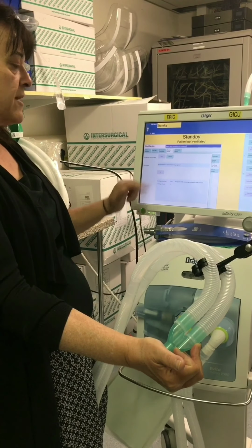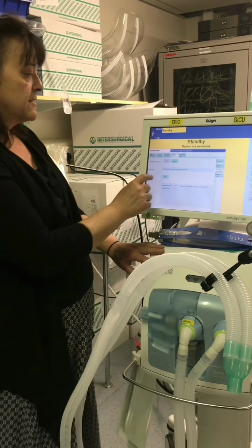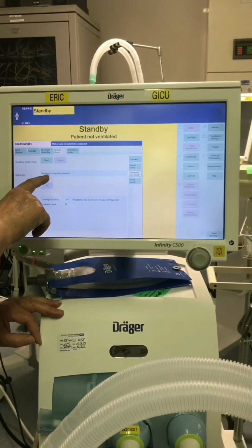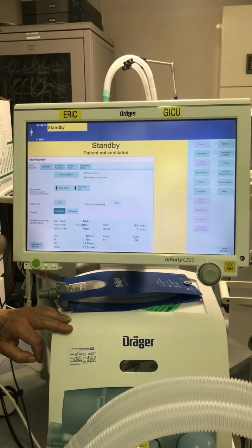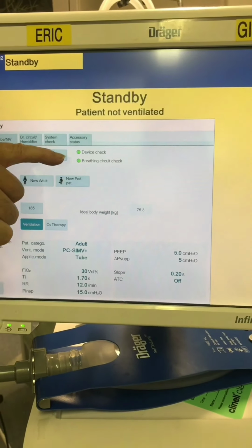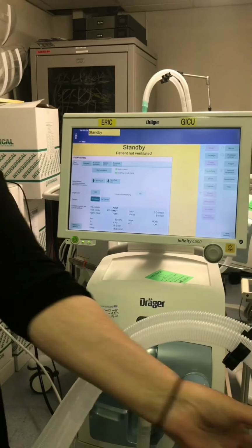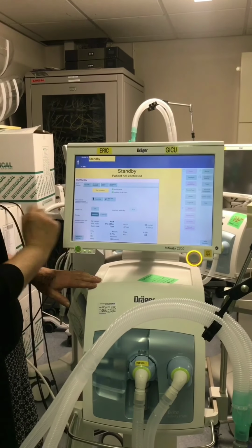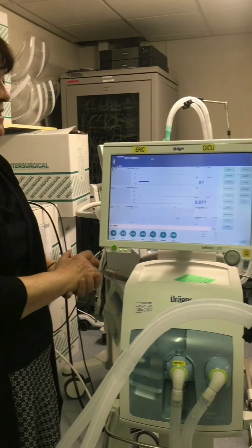Now it's checking the compliance and resistance. Now it's asking me to open the connection port. Press OK. And it says breathing circuit check finished. If I now go back to start standby, I can see on the screen very clearly that my device check is green, my breathing circuit check is green. Now we can attach to our patient using our HME and start ventilation, highlight and confirm, and then carry on to use your ventilator as per normal.